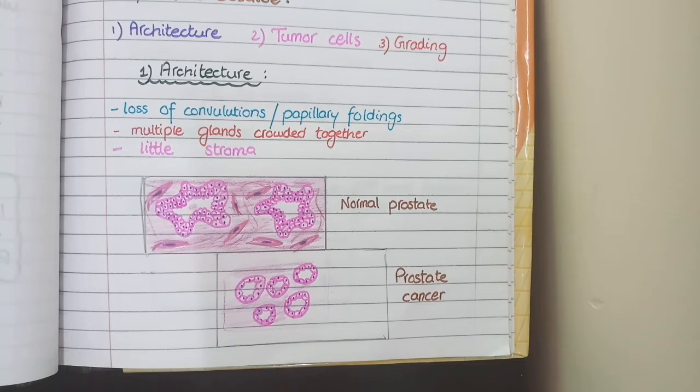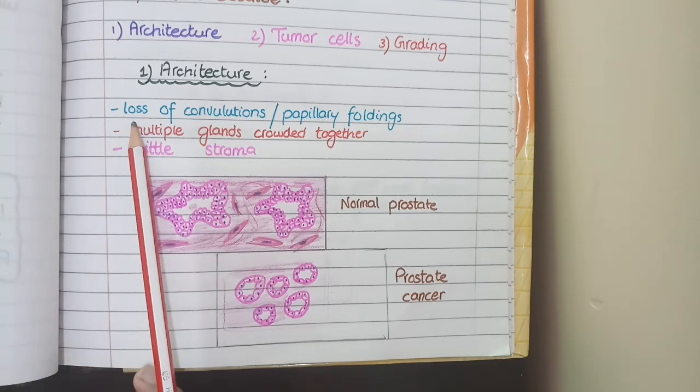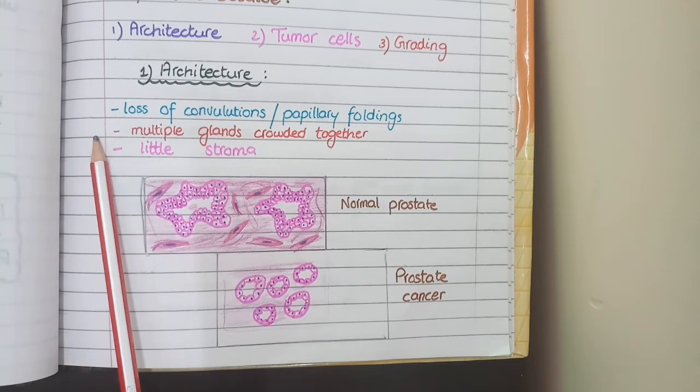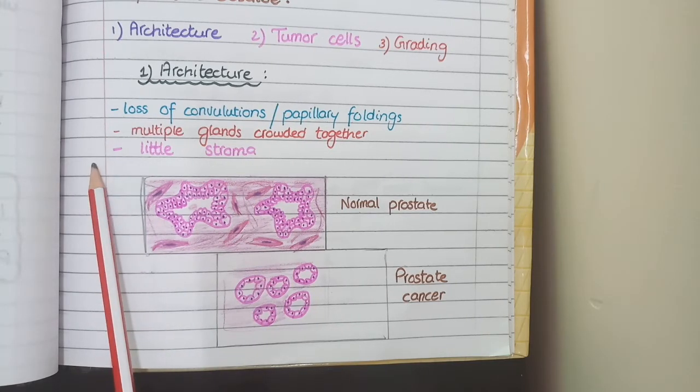So overall, the architecture of prostate carcinoma is such that it shows loss of convolutions and papillary foldings. You see multiple glands crowded together and there is little stroma.